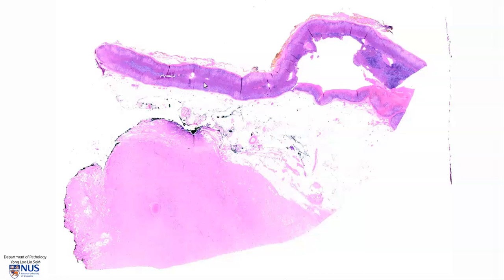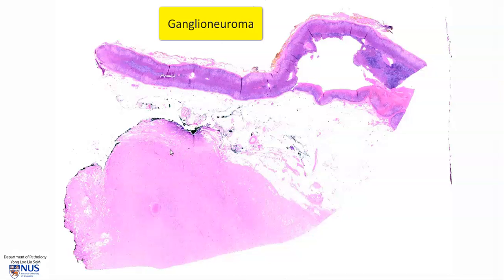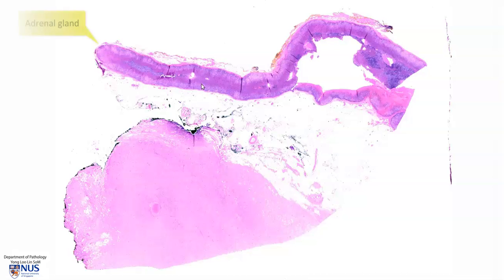This is a virtual microscopy slide from a ganglioneuroma, which is a benign tumor that arises from neural crest cells. This particular tumor is located in the fatty tissue around the adrenal gland.